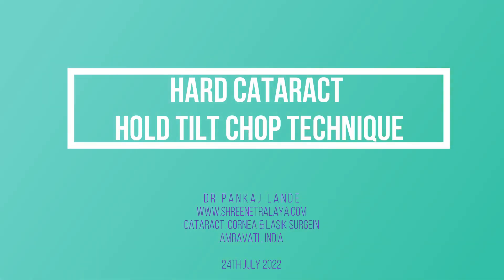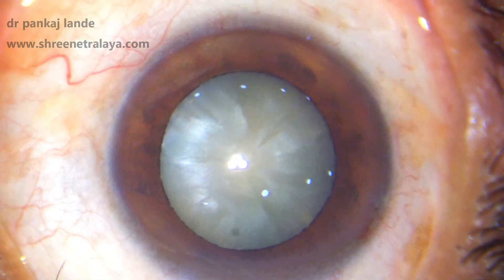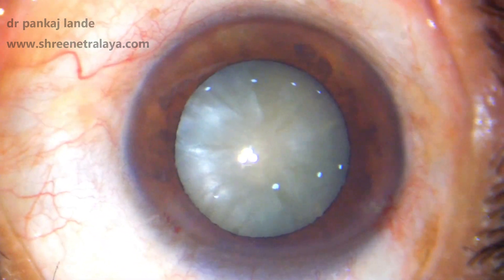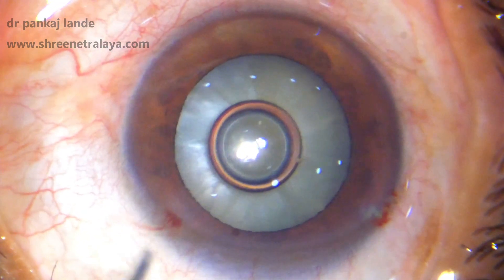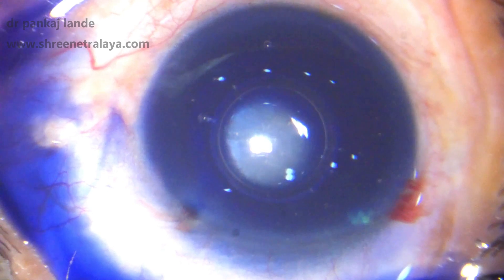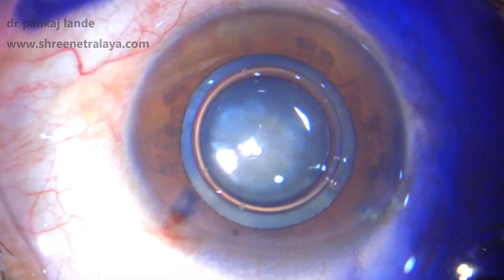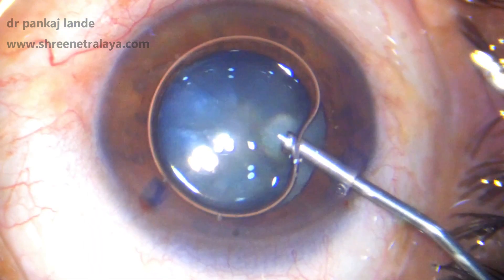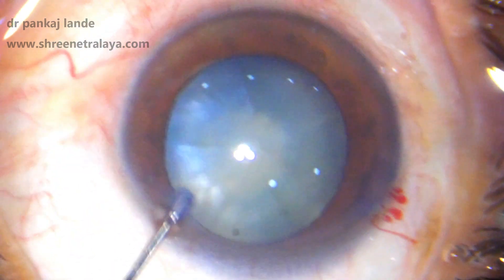Hello friends, welcome to Srinethralam. In this video I will show you a hard cataract and how to chop it easily. Whenever we are dealing with hard cataracts, it is very important to get a good CCC. I'm entering with my 2.6 millimeter main port and 23 gauge side port. I'm going to stain my capsule with Blu-Rex. Once that is done, CCC with cystitome is completed.